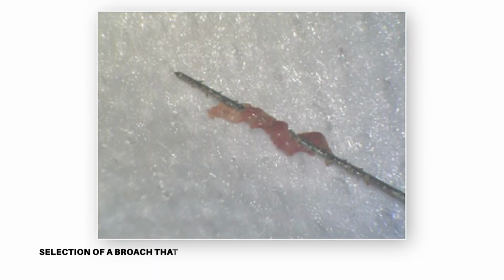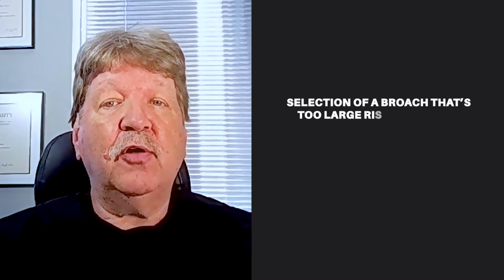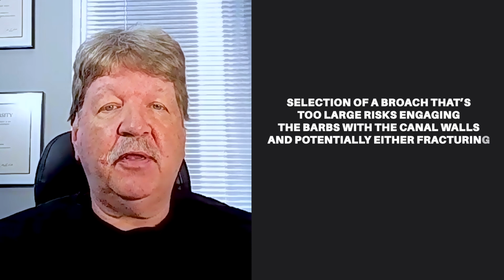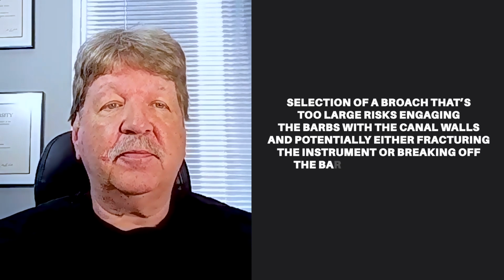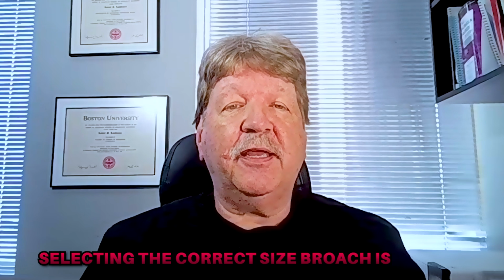Selection of a broach that's too small will result in the broach just piercing the pulp but not engaging it sufficiently to entangle itself and remove the pulp in its entirety. Selection of a broach that's too large risks engaging the barbs with the canal walls and potentially fracturing the instrument or breaking off the barbs and having them obstruct the canal. Selecting the correct size broach is the key.